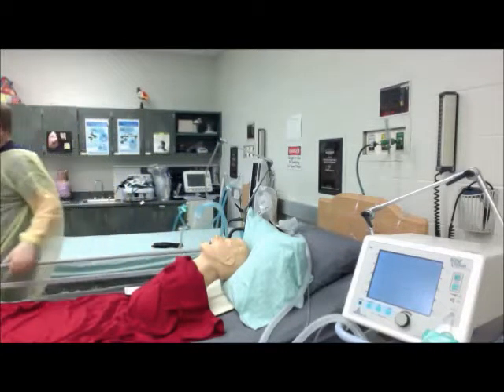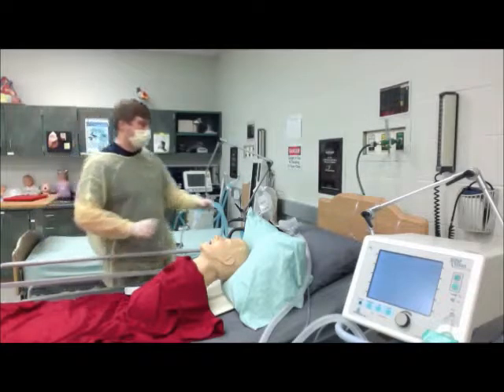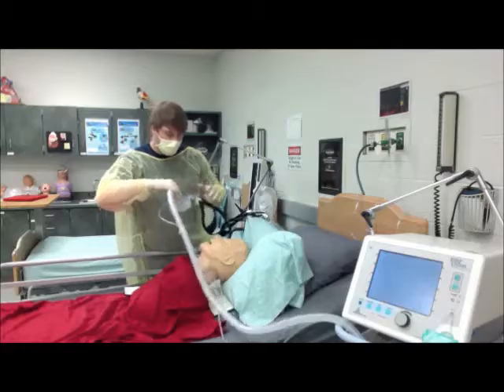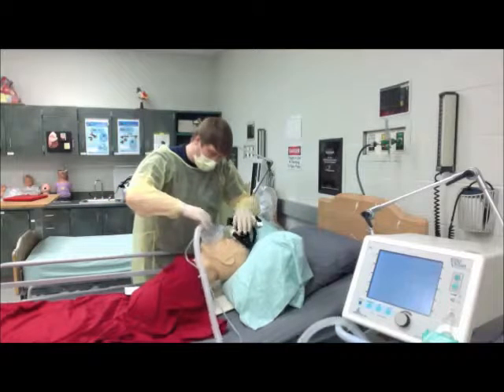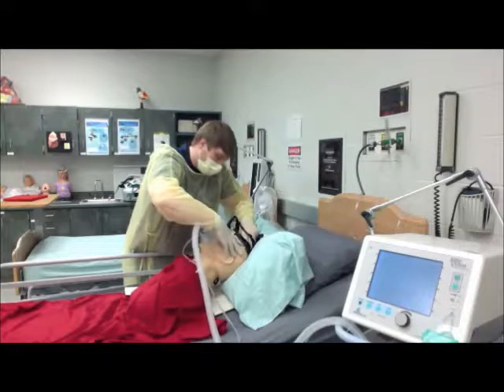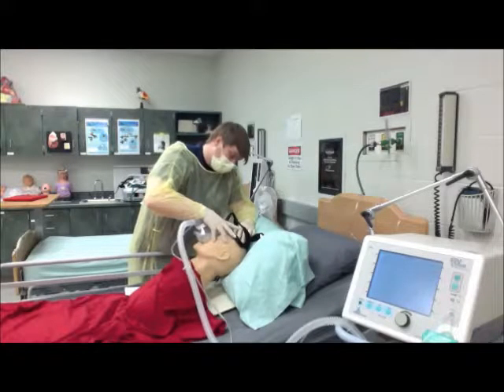So now we're going to put her on the face mask. In this case, we're going to do a face mask as opposed to a nasal BiPAP because she's a big mouth breather. So we're going to do the mask and benefit her the most.